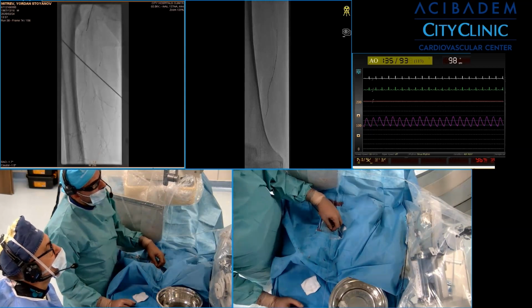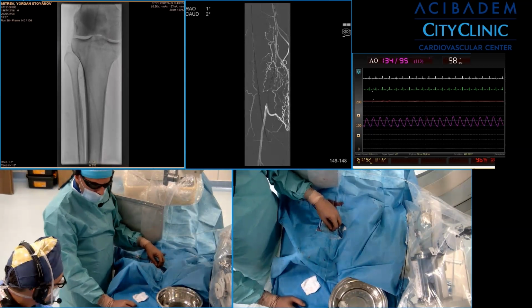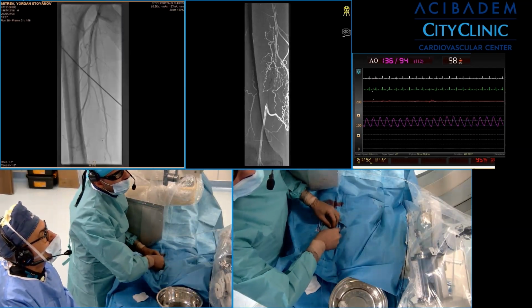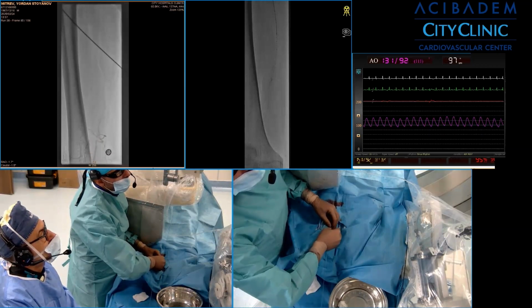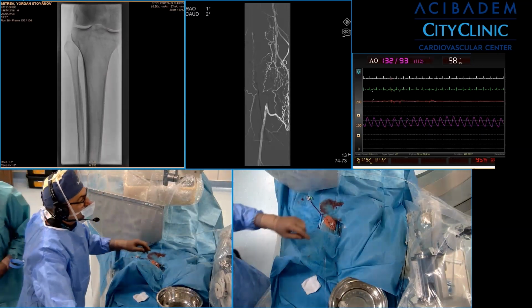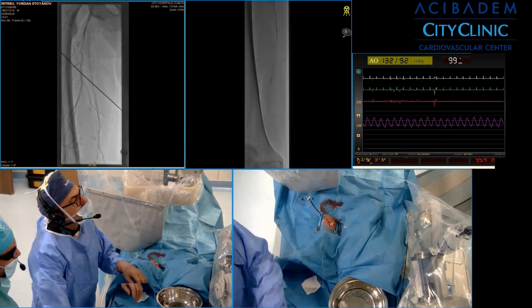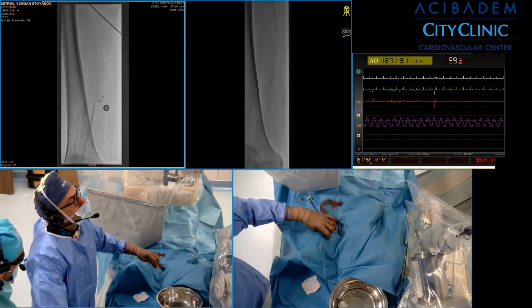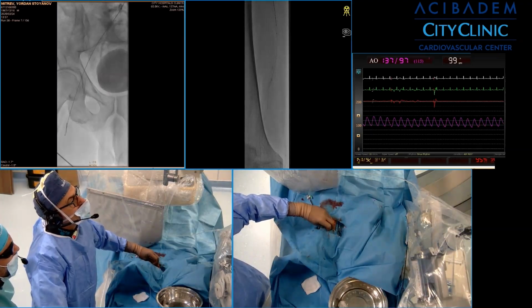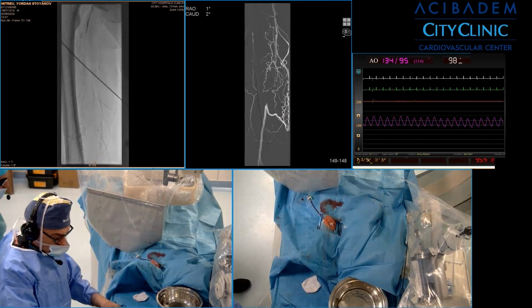Yeah, I'm inside. Okay, good. We succeeded. Advance the microcatheter. Remove the roadmap. Okay. Definitely, there is very free movement of everything, so obviously we are no longer subintimal. And now, like in coronary procedures, we are going to replace the penetration wire with a supportive one.